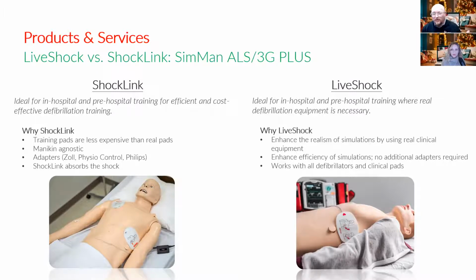Now, LiveShock is only available on certain mannequins, and the one we're going to concentrate on today is the SimMan 3G Plus. It's the new SimMan 3G Plus that just got released, and it comes with LiveShock. This really enhances the realism of your simulation when it comes to defibrillation. You're taking your real clinical defibrillator and your real clinical pads, and you are shocking the simulator. We really started to look at this in regards to adult learners, applying the real things without any adapters. And the cool thing is that every defibrillator will work this way.